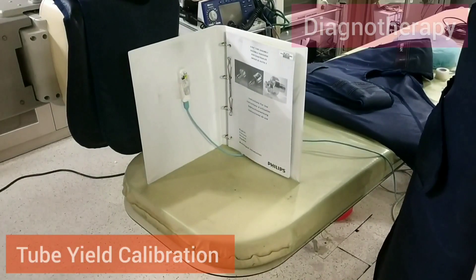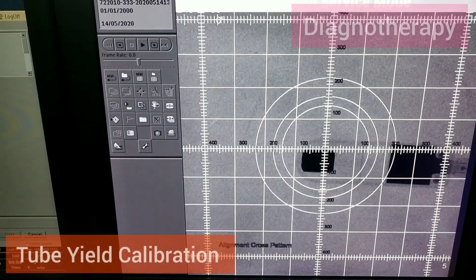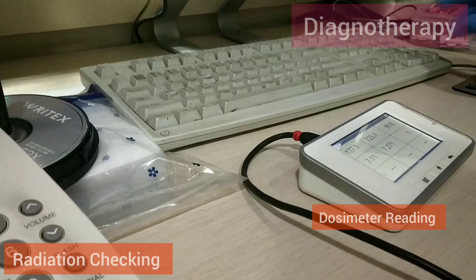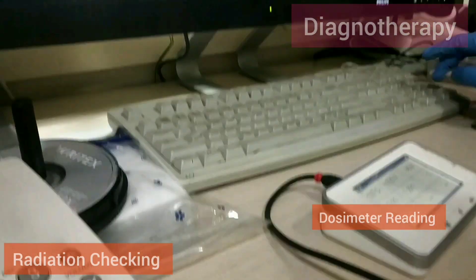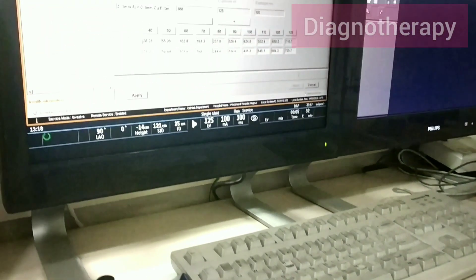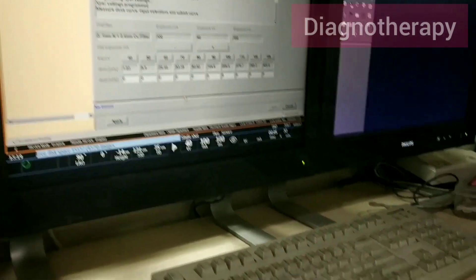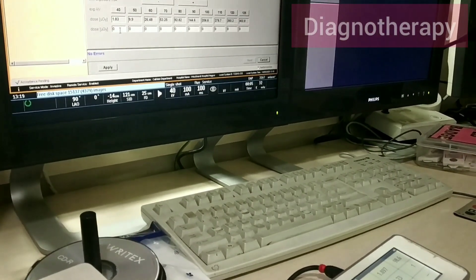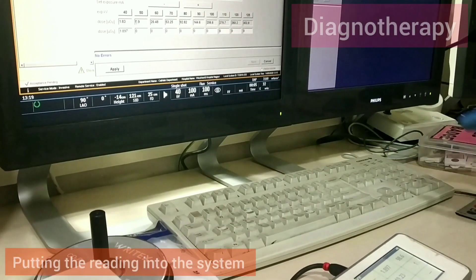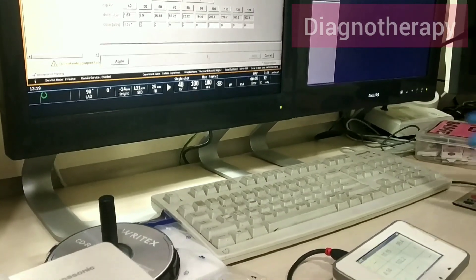We measure the distance between the detector and the X-ray tube to verify it is correct. Then for radiation checking, we check the values on the dosimeter and feed those values into the system. At different settings, we note how much reading we are getting on the dosimeter and then input those readings into the system.